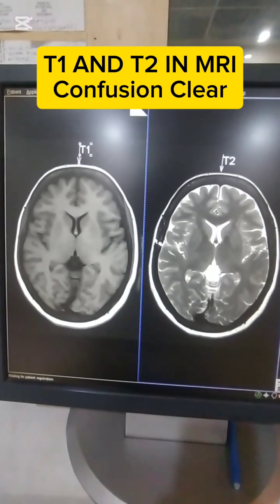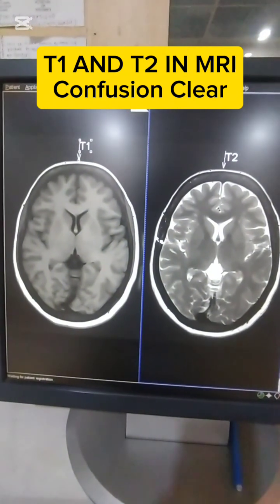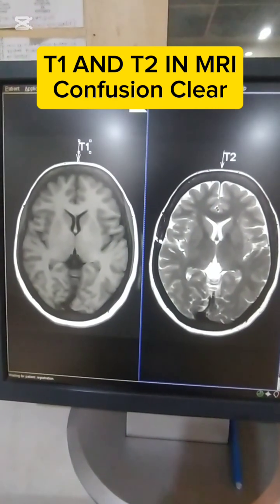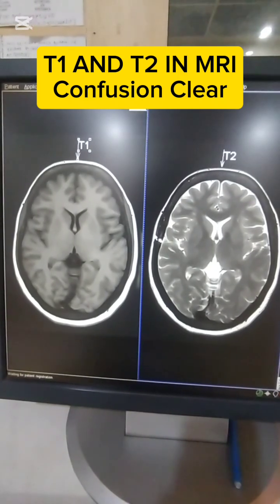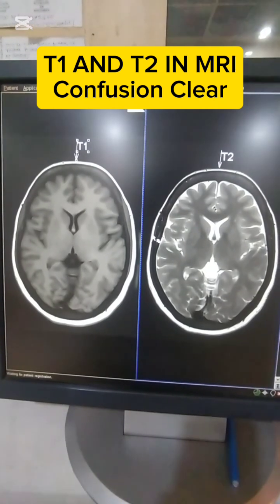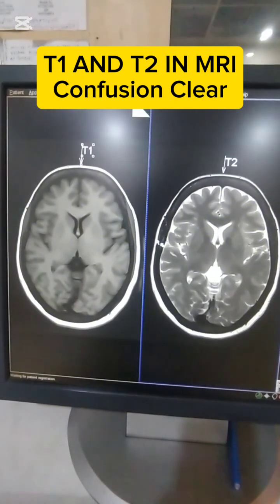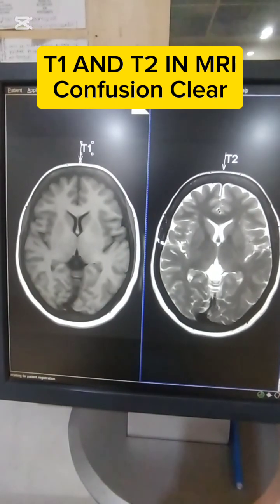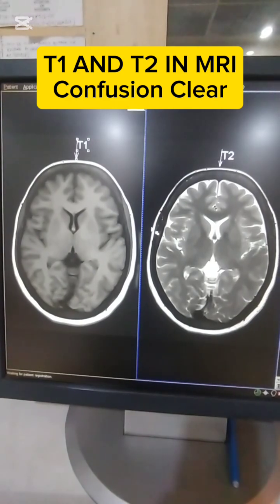These two processes are separate, and they take different times to complete. Each tissue, or each hydrogen nucleus, has two processes after the radio frequency pulse, and these two processes have two different times, which are termed T1 and T2. I am not going deep, I am just trying to give an idea about T1 and T2.